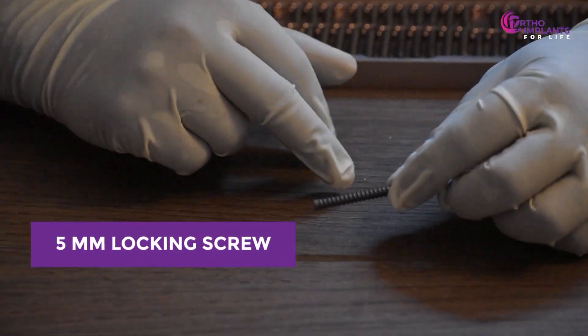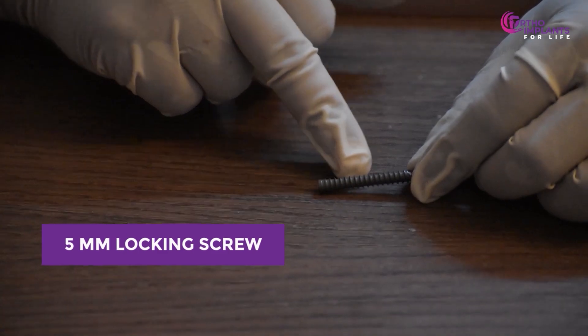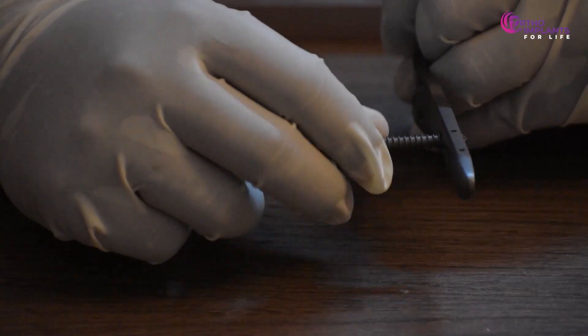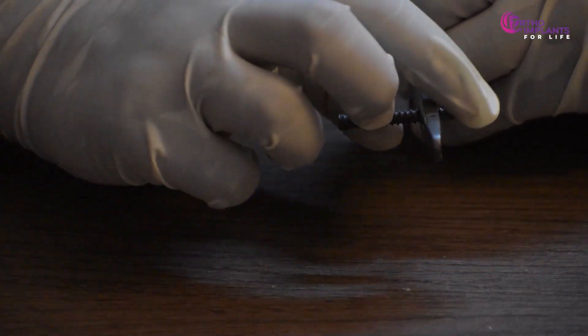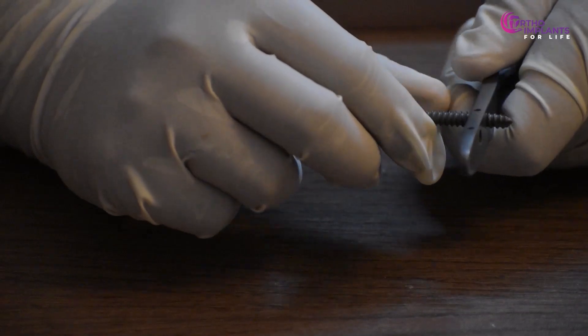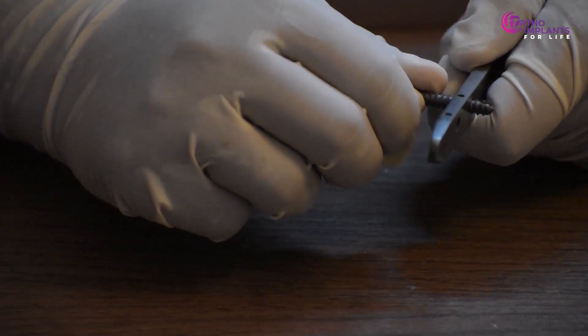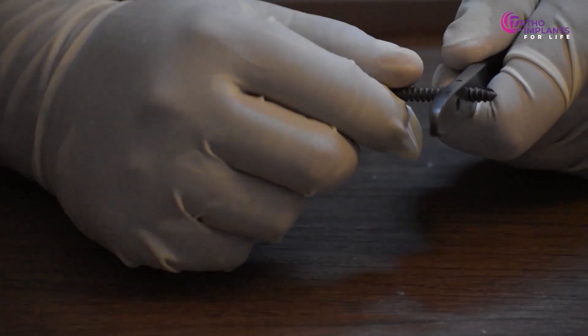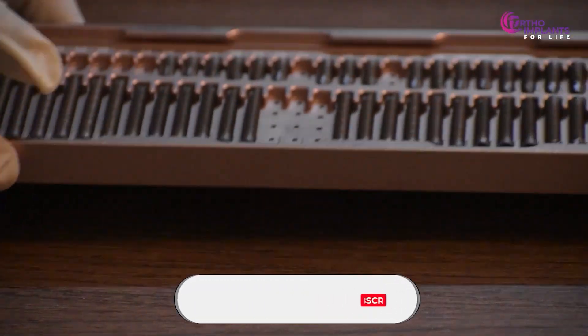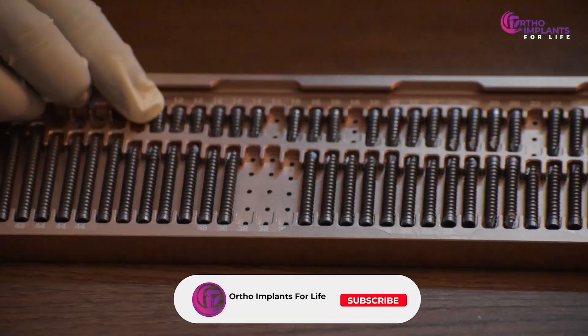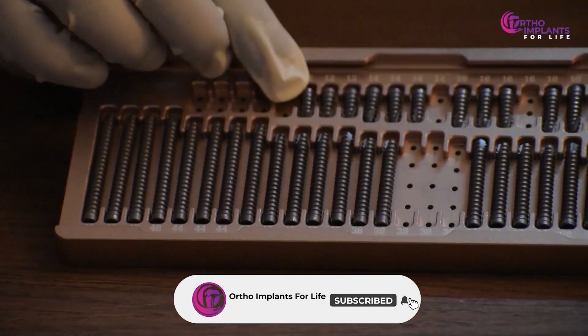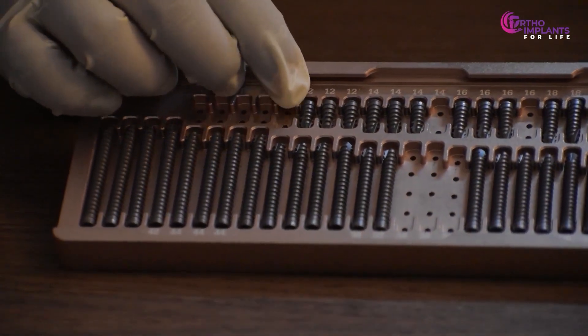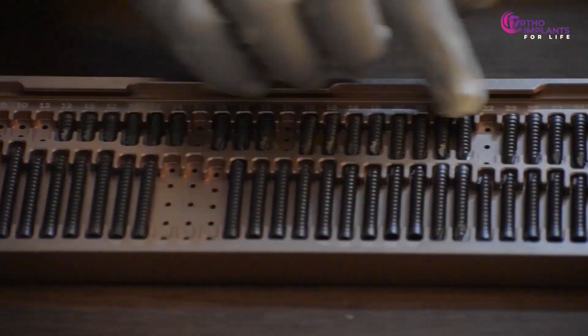This is the 5 mm locking screw for the periprosthetic plate. It's called a locking screw because, once it's inserted, it locks the plate because of these threads here. We don't have to even go all the way through with the screw to lock. As you can see, even if I am pulling the screw, it is stuck. These screws are specifically designed for the periprosthetic plate, with lengths ranging from 20 to 60 mm and a 5 mm diameter.